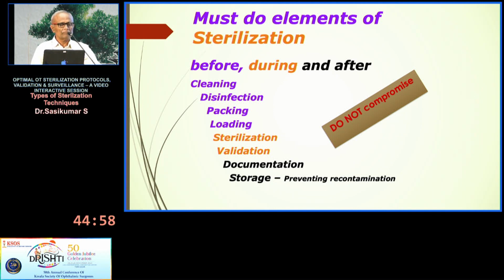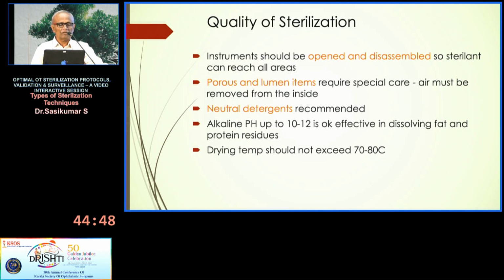If the instrument contains about 10 million spores, then at least 10 spores will survive. That can cause havoc in your surgical outcome.